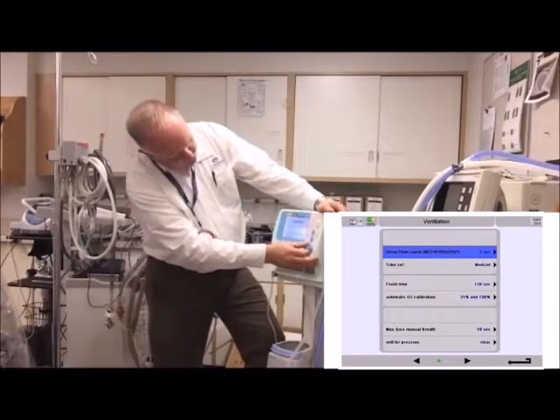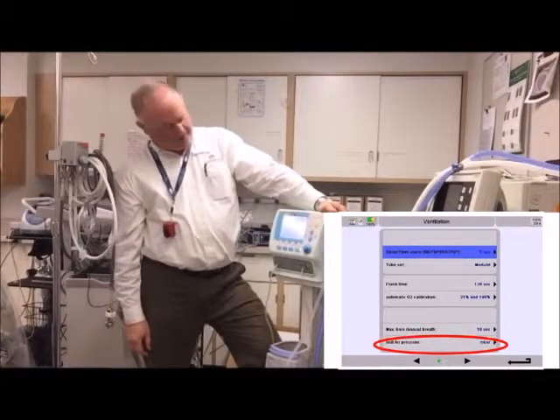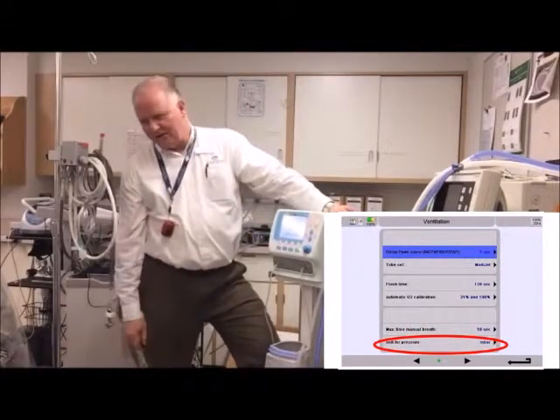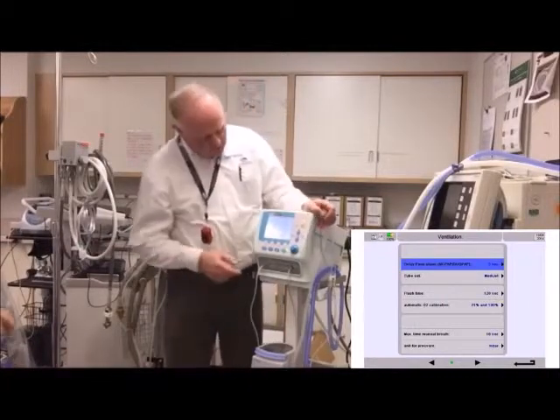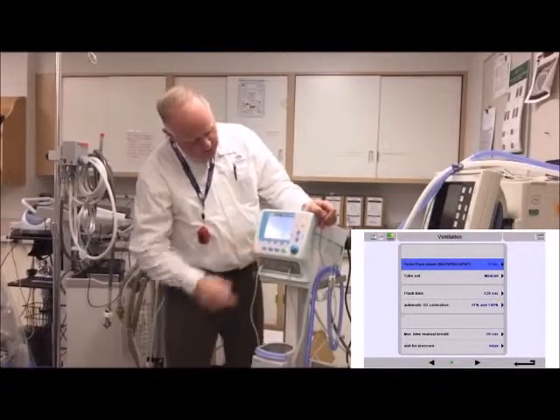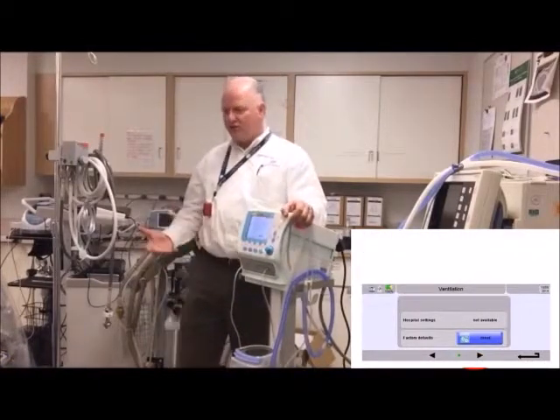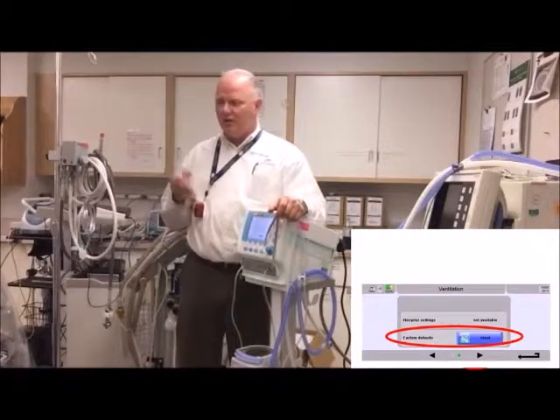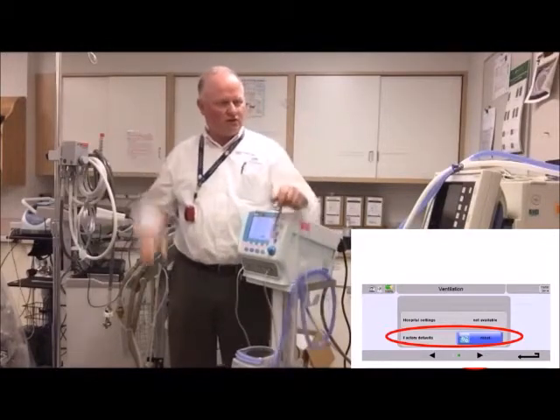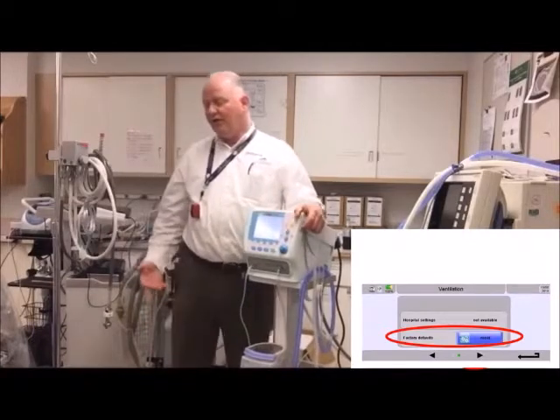Down here, units of measure — you can have millibars or centimeters. We're in Canada, so we'll use centimeters. There's also a menu where you can reset to factory defaults, or program in hospital-specific defaults as your own custom defaults. When you hit that, it applies those. For now, those still have to be programmed.